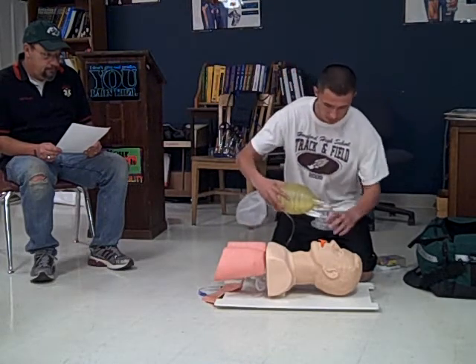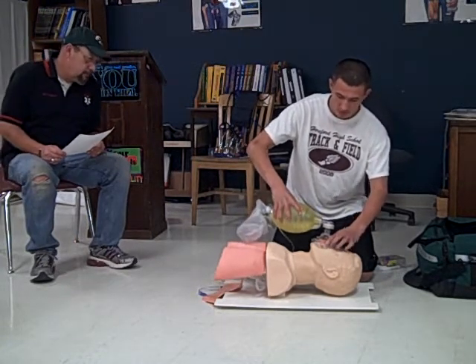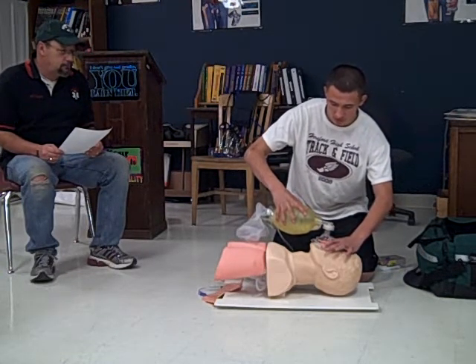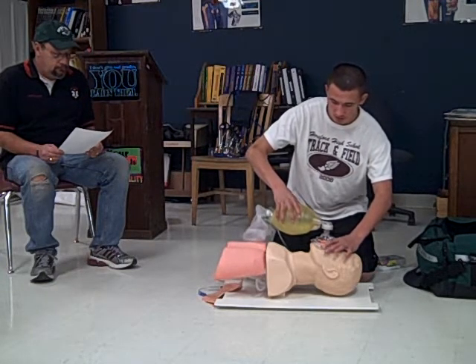Now we'll begin to ventilate. One-one-thousand, two-one-thousand, three-one-thousand, four-one-thousand, five-one-thousand. One-one-thousand, two-one-thousand, three-one-thousand, four-one-thousand, five-one-thousand.